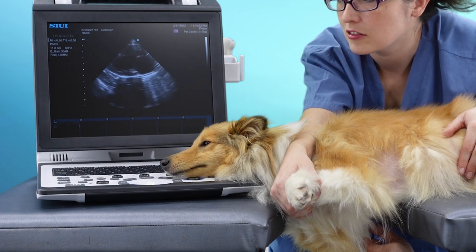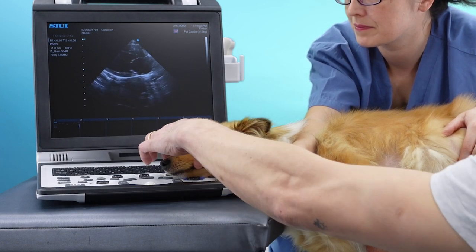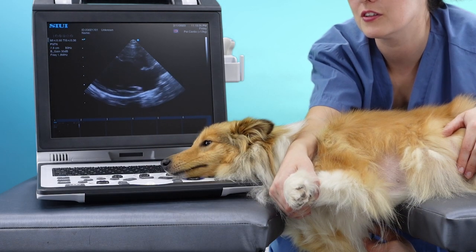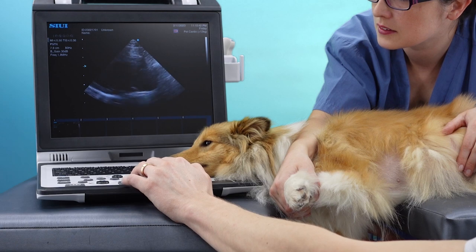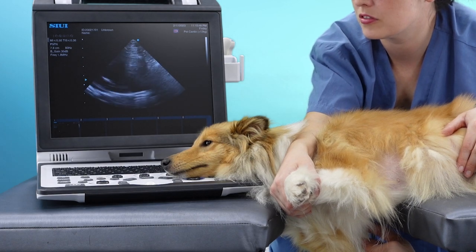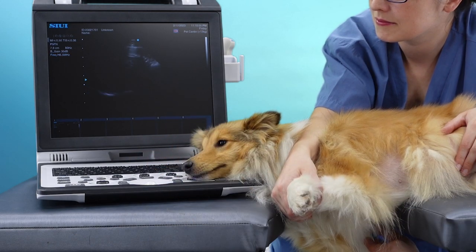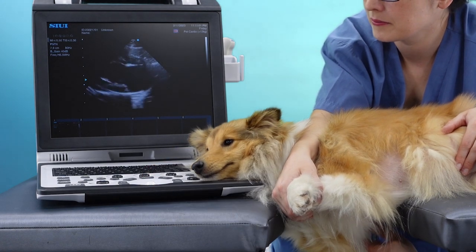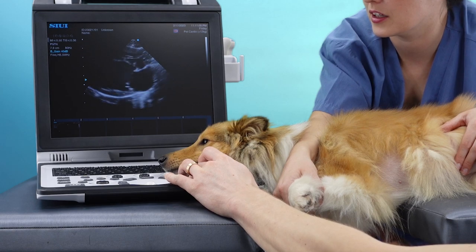When you first start scanning, remember to optimise your depth, gain, frequency and focal point. Let's start with depth — reduce this so that the ventricle fills up most of the image. Move your focal point down to the level of the free wall, and use the highest frequency possible for your patient. If your image is too dark, then remember to turn up your gain. And if it's too bright, then turn your gain down.